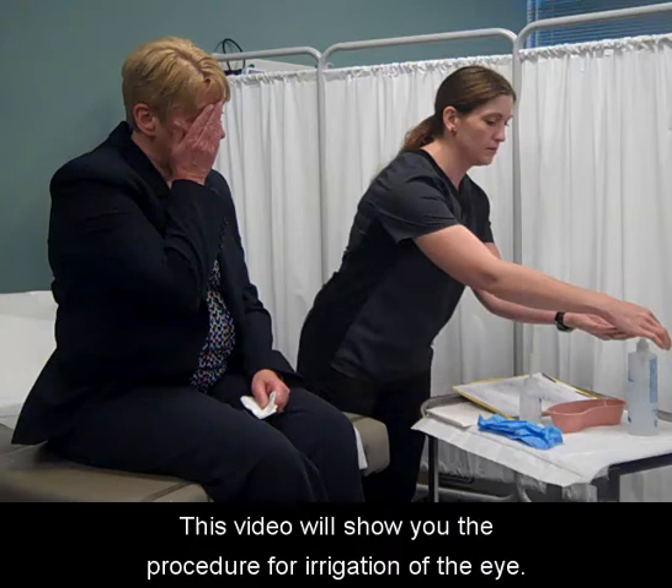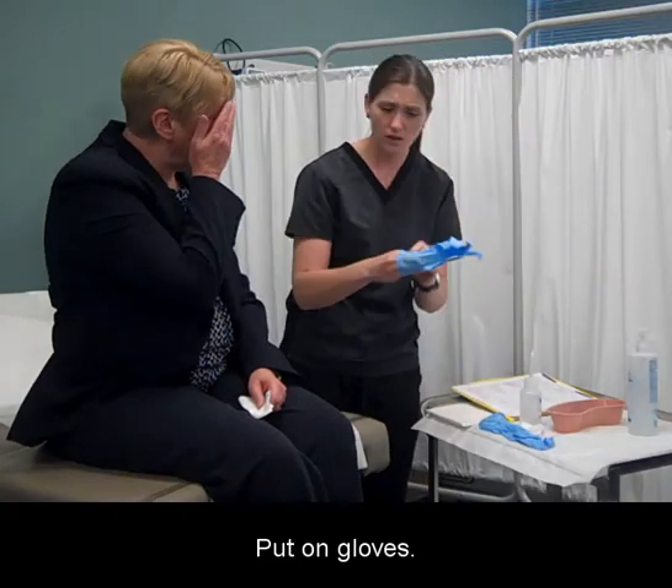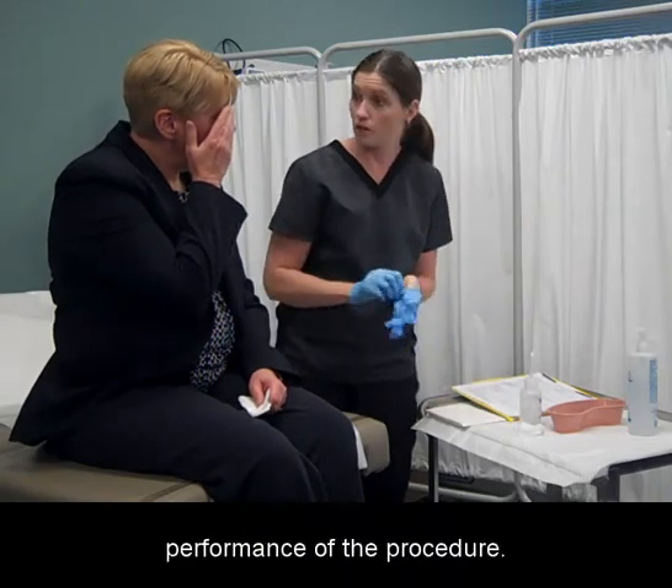This video will show you the procedure for irrigation of the eye. Wash your hands, put on gloves, identify the patient, introduce yourself, and explain the rationale for performance of the procedure.